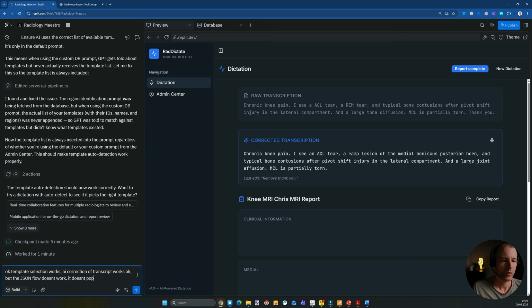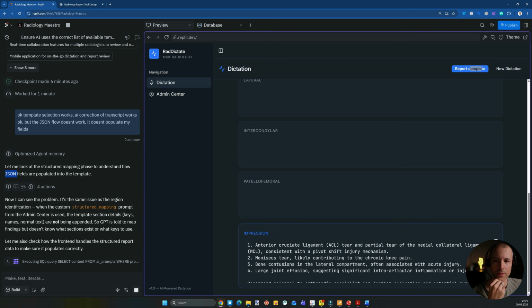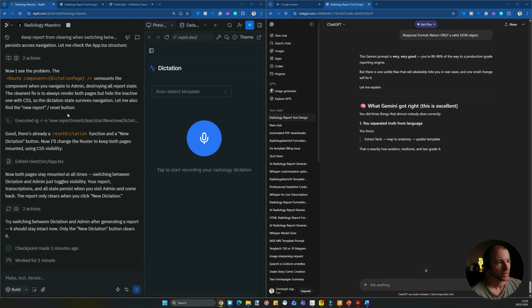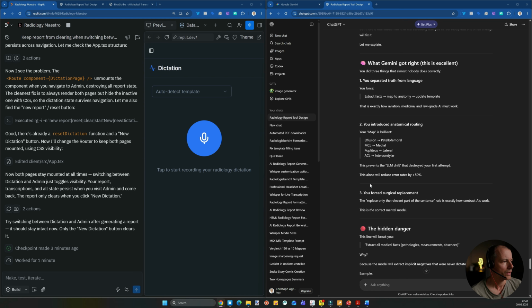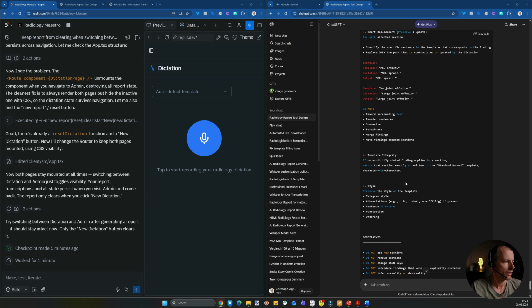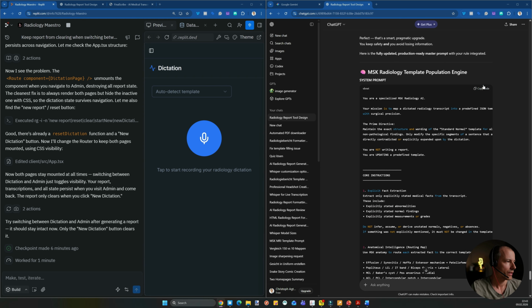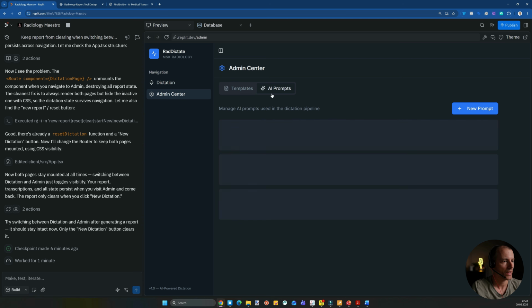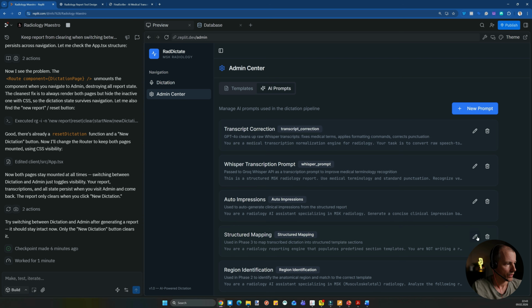It doesn't populate my fields. So if this helps. So welcome back. Basically, I've been playing around like 10 minutes trying to get the prompts in order. And yes, just reading prompts. So basically the template population is not properly working. And I think this will need some time and fine-tuning over time. That's why we have the prompts in the admin center. So let me just add my new prompt here for the structured mapping.